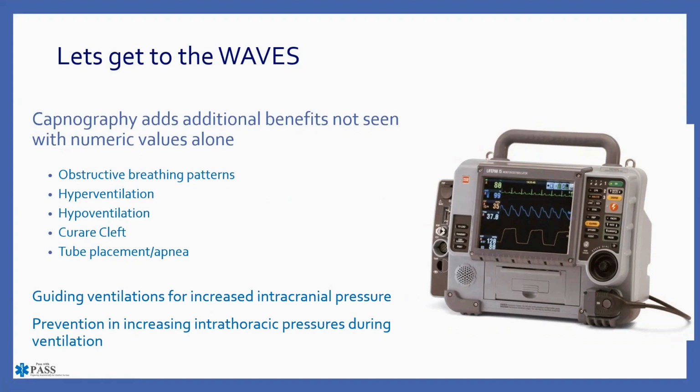There's some talk from the folks that make the EMS protocols about doing away with adult bag valve devices. We don't need that much.